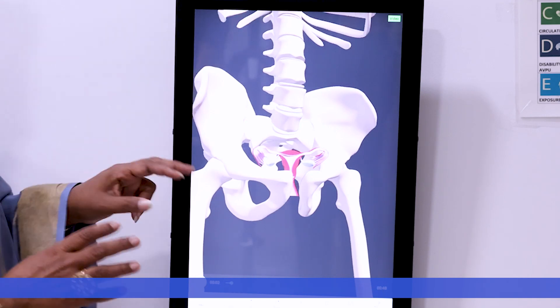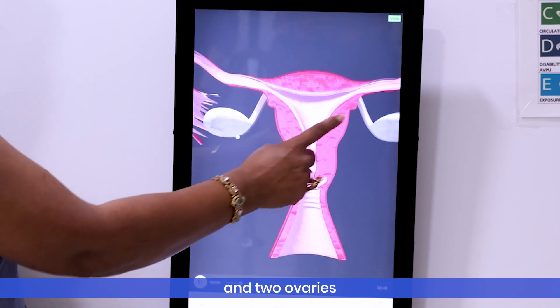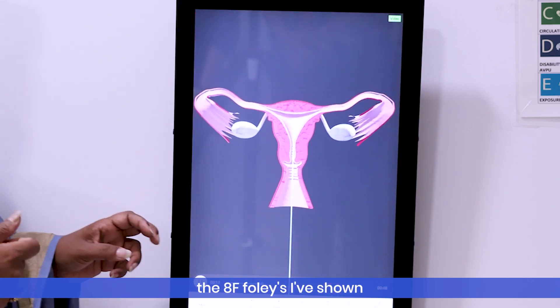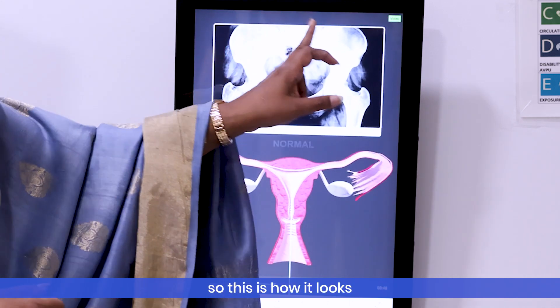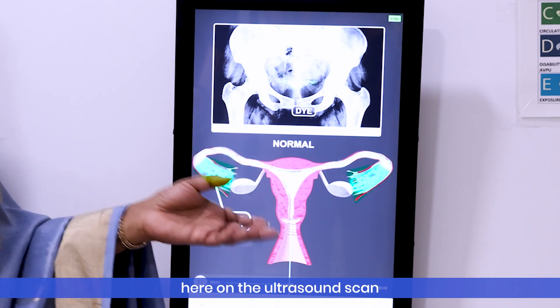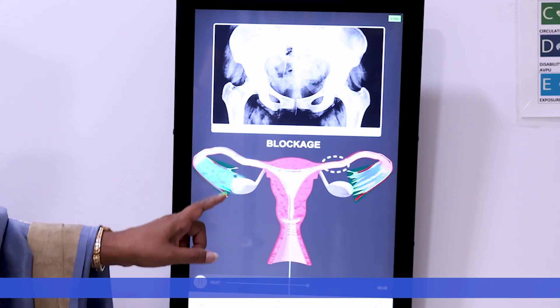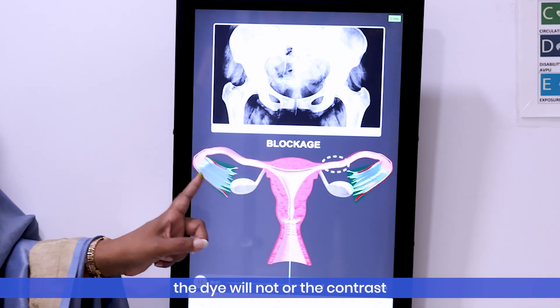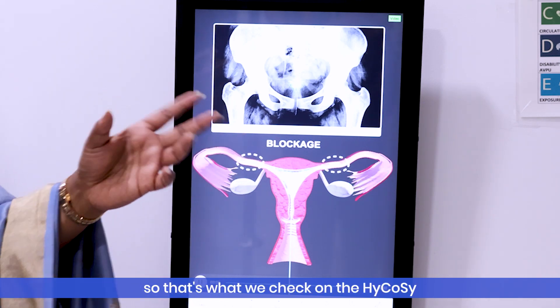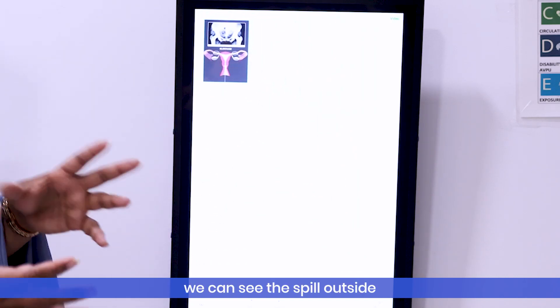To explain HyCoSy with an animation: in the female body you have the uterus, two fallopian tubes, and two ovaries. The cervix is the neck of the womb — we pass the tiny 8 French Foley catheter through it. On X-ray the dye looks green; on ultrasound scan it looks black and white. If the tubes are open, the contrast comes out of the tubes, but if the tubes are blocked anywhere, the contrast will not come out — that is how we diagnose tubal blockage.